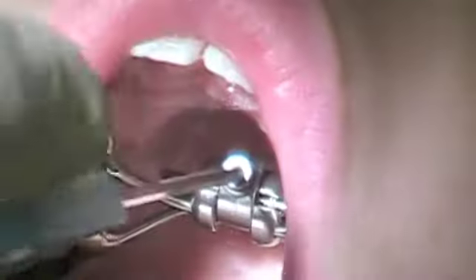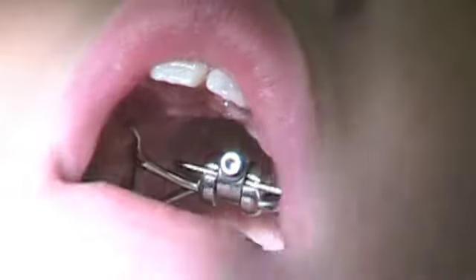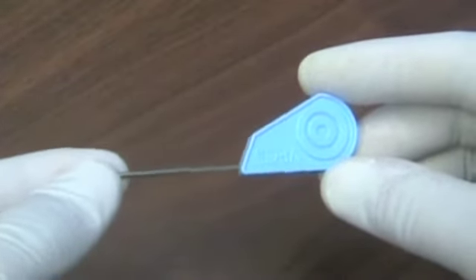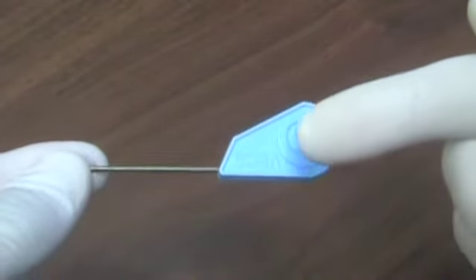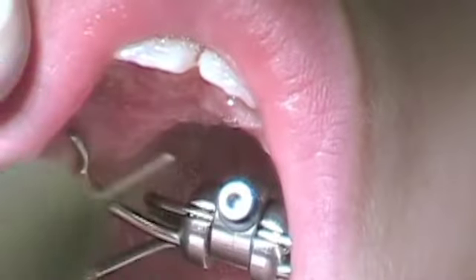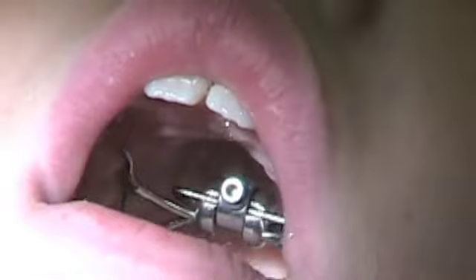Once you feel that the key is engaged in the activation head, turn the key in a radial motion similar to how you would turn a car key or a house key. To ensure that the expander is being activated in the proper direction, notice the target symbol on the key and push on this. You will notice one side of the key has a target and the other side is blank, to avoid any confusion in regards to the proper activation. Once the proper doctor-instructed activation has taken place, simply take the key out of the activation screw head.